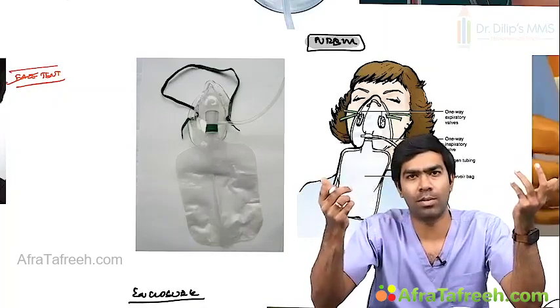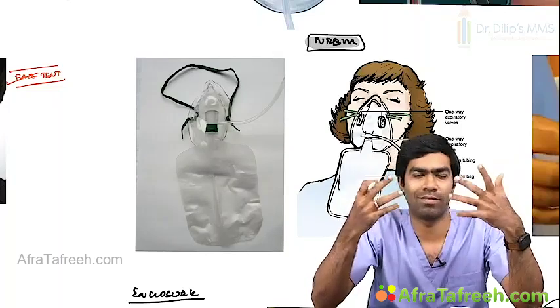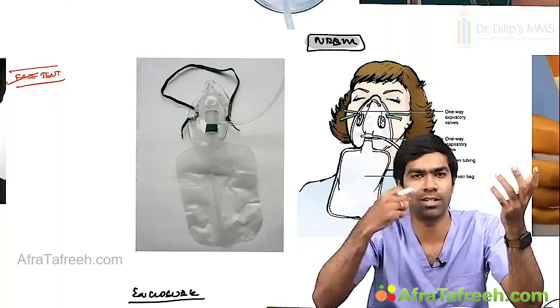Simple. How will you create a non-rebreather mask? You have to change the mask and put a valve. Where do you have to put the valve? You have to put the valve in the reservoir area. That's all.